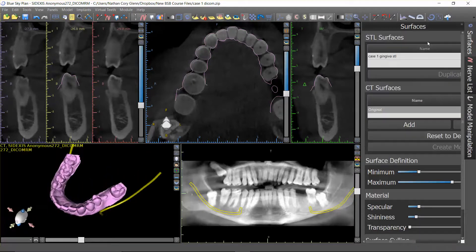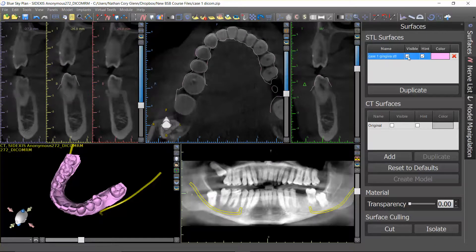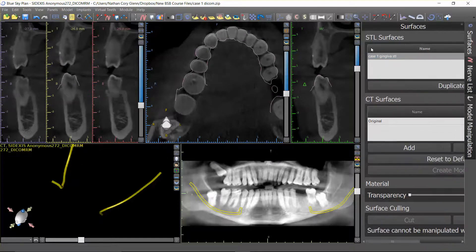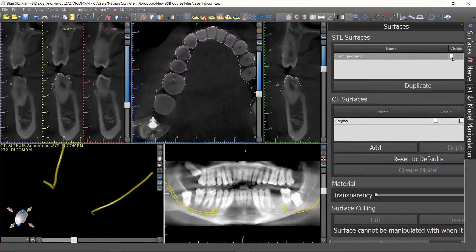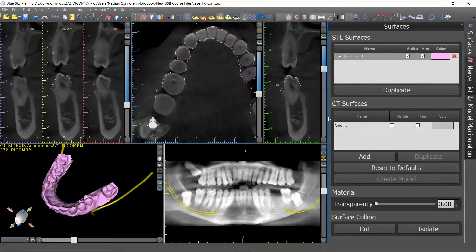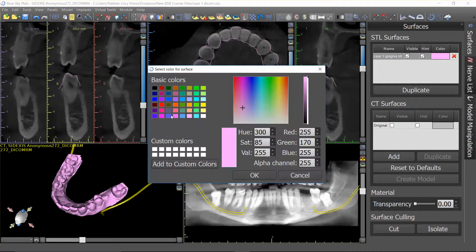Up here you've also got your STL models — the hint is this model outline toggle. If I turn that off you see how the model outline disappears; turn it back on and it reappears. Visible simply makes it visible or invisible in the 3D rendering window. If you want to change colors, all you have to do is click on the color and you can change the color of your STL model. This is very intuitive in that window.